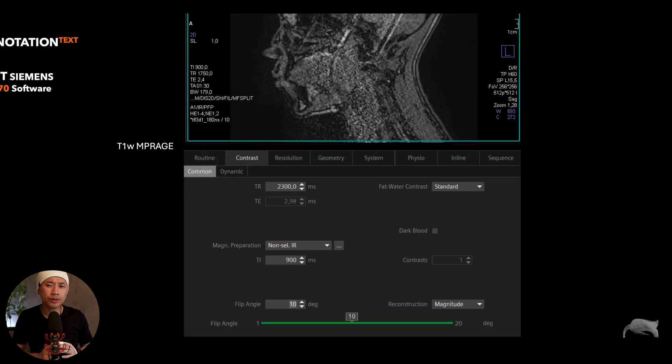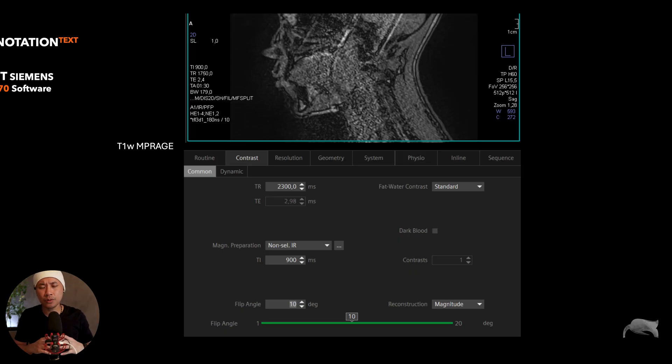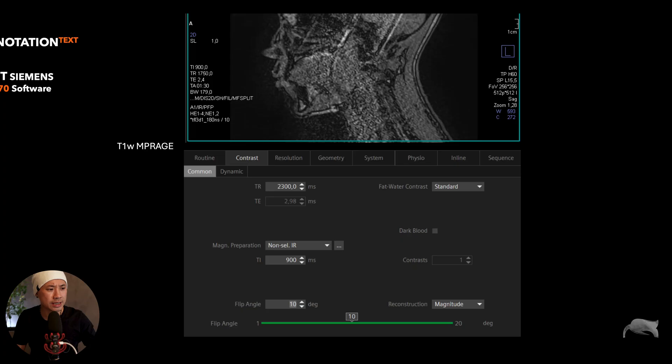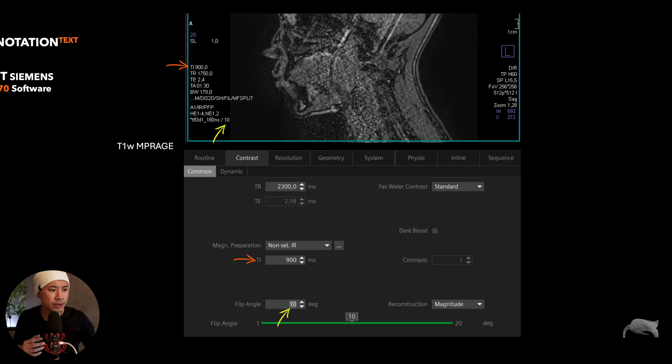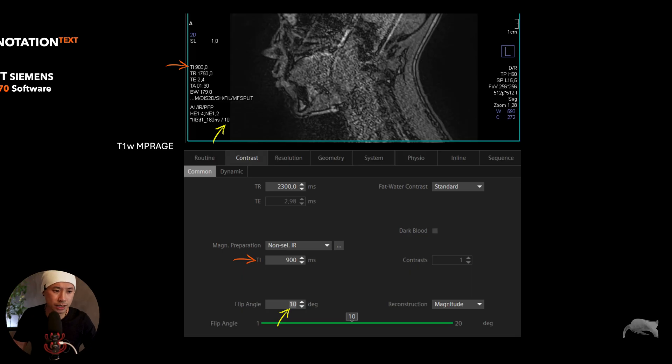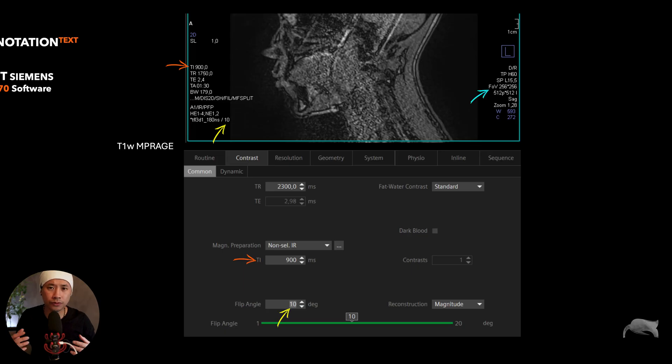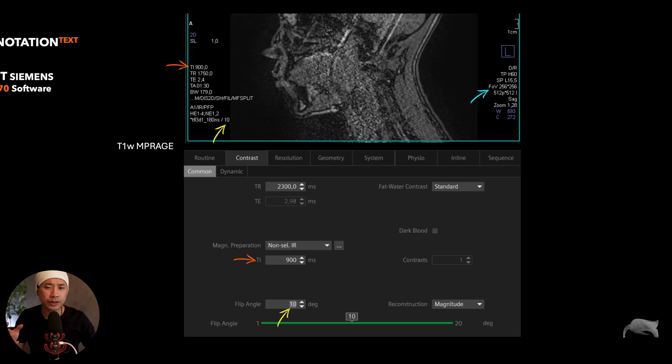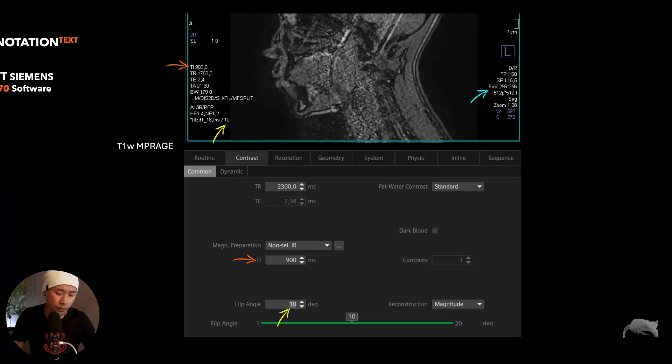And let's move over to T1 MPRAGE. MPRAGE is widely used for brain imaging. It's not too much to say here, there's more or less the same information. You have the slice, but I just want to say to you the TI time - it says right there. And then you have a flip angle, says right there. And then echo train is 180 and it's also here. And that's non-selective. And without looking at the parameter right here, I can see that we are having a field of view 256, and then we have an interpolation mode on for 256 with interpolated mode, so now it's 512. So that's how it is.